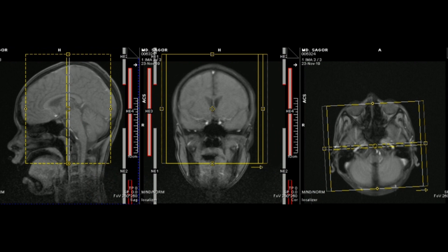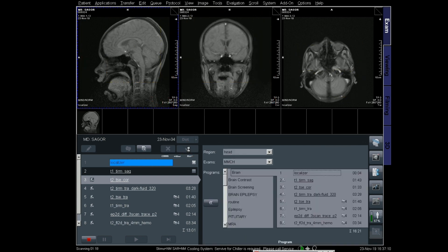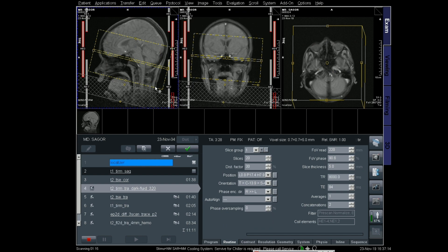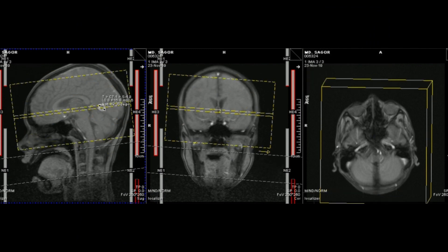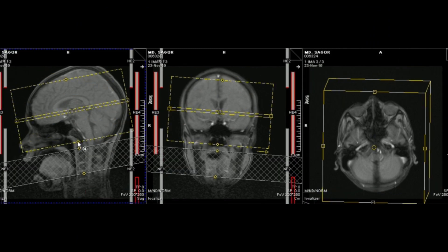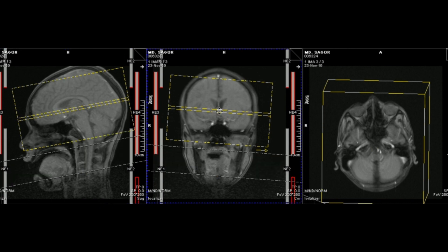Cover from the frontal sinus to the occipital protuberance, then click apply. Now to plan the axial slices: to get axial images, plan on the sagittal and coronal images.